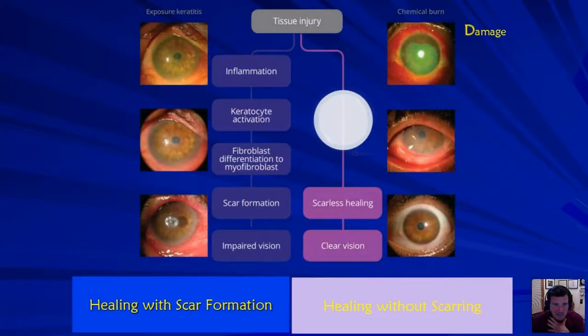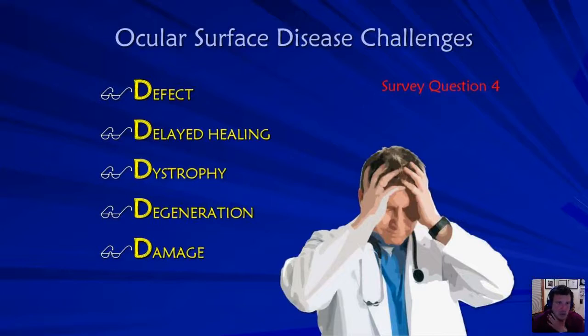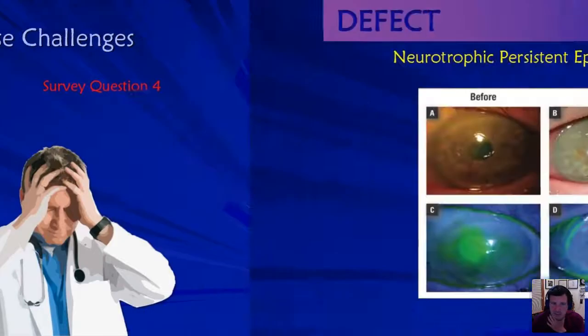And again, I think we beat this to death here, we want to get away from something like this, the thinning of the cornea, maybe the haze and the fibroblast. And we want to get where we can insert a membrane and get a nice clear cornea in the office and treat these patients. So, ocular surface disease challenges. Where can we use this membrane?